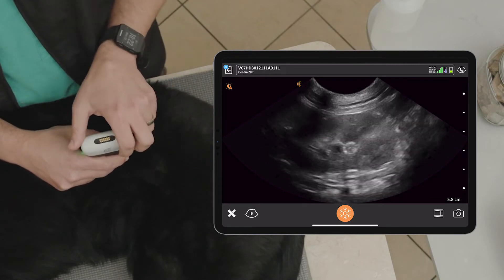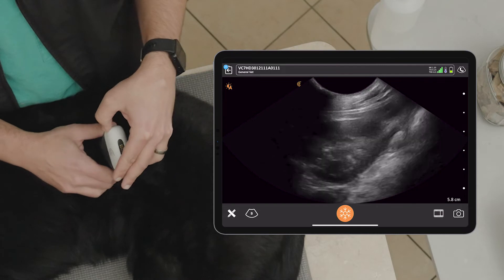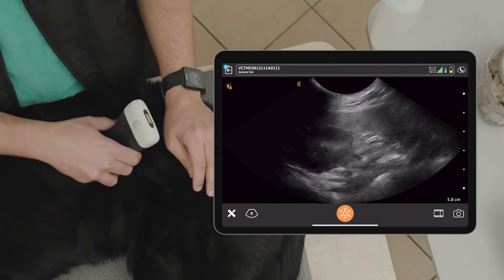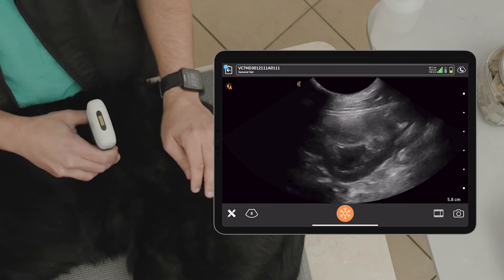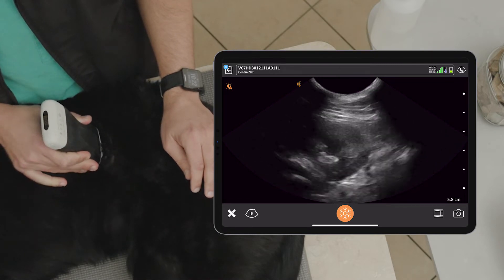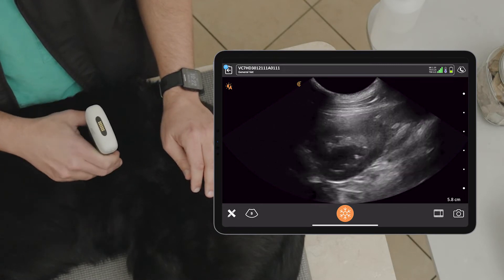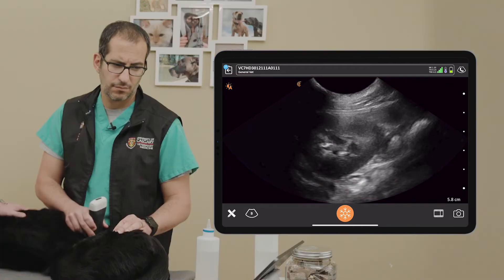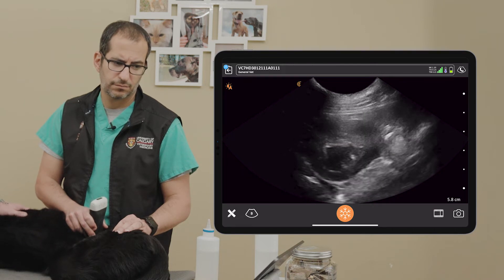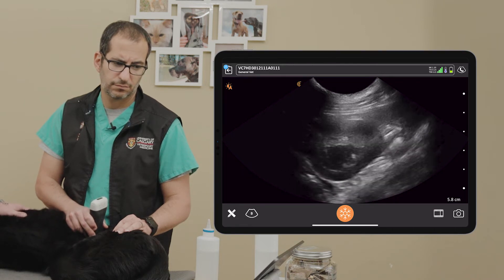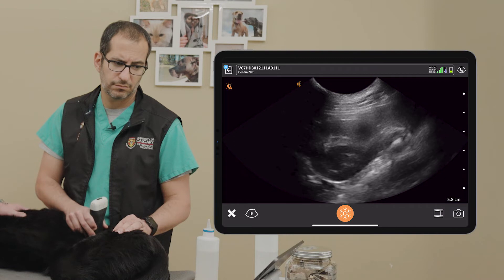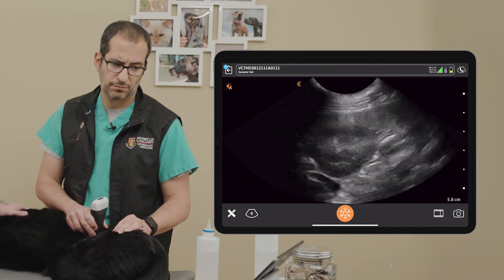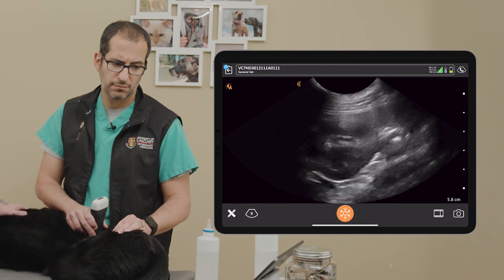And just like on the right paralumbar site, we're also going to look for the short axis, and we're going to fan all the way through one side of the kidney and all the way through the other side, looking for free fluid or retroperitoneal fluid. And because this is the non-gravity dependent site, we're going to look for free air at this location as well. We're going to find that peritoneal lining, and we're just going to check for that reverberation artifact and enhanced peritoneal stripe sign to look for the presence of free air in the abdomen.